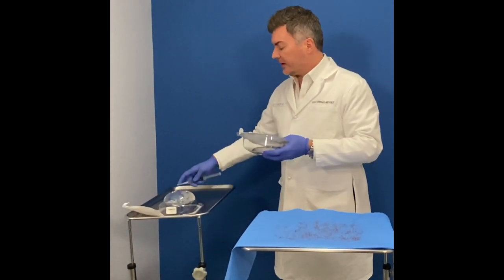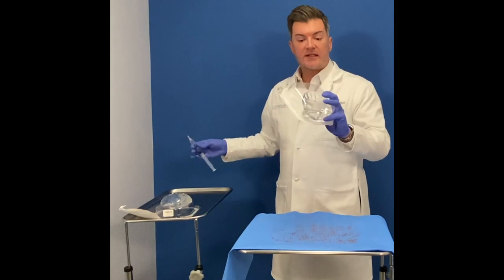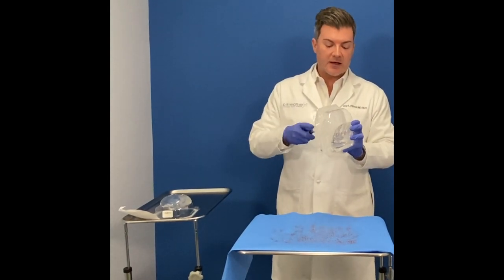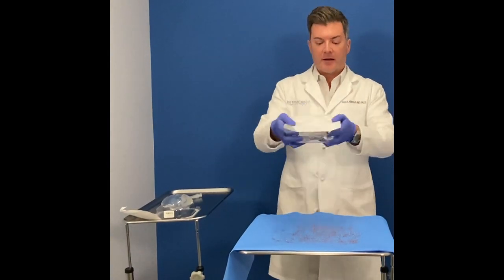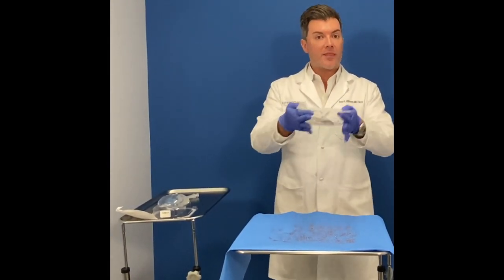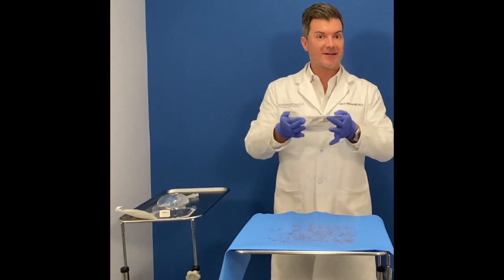Now we're going to actually take fluid. This is saline, but typically I use Betadine. We squirt this in the implant packaging. We wet that. So this is the video that you guys see all the time on Instagram.